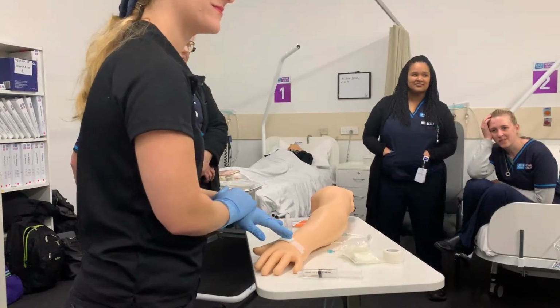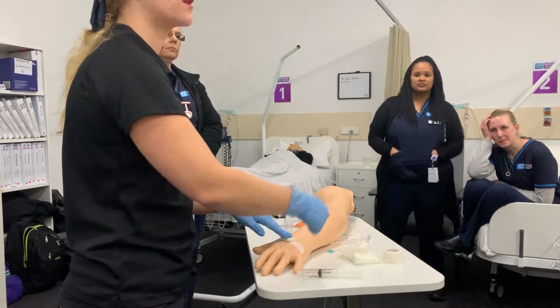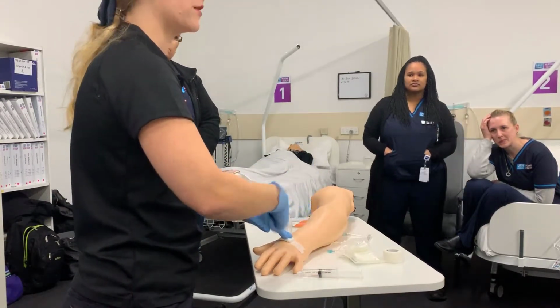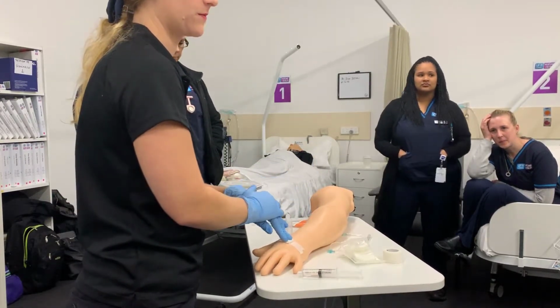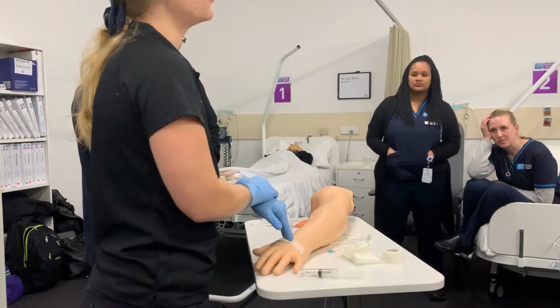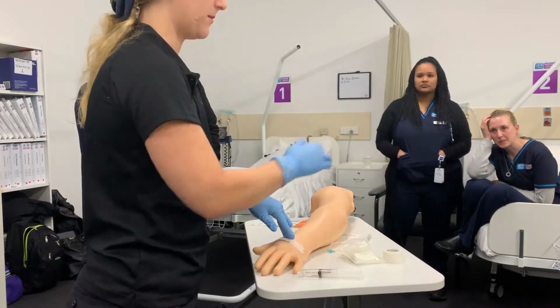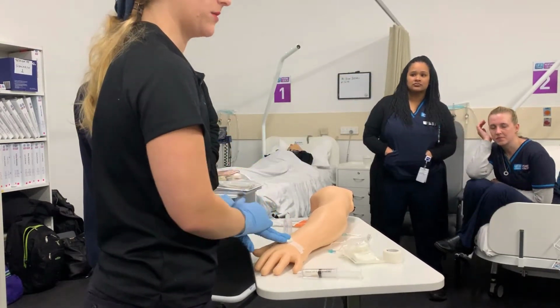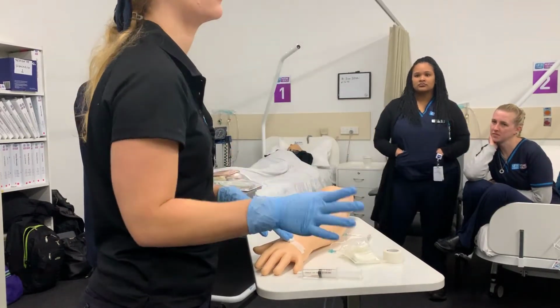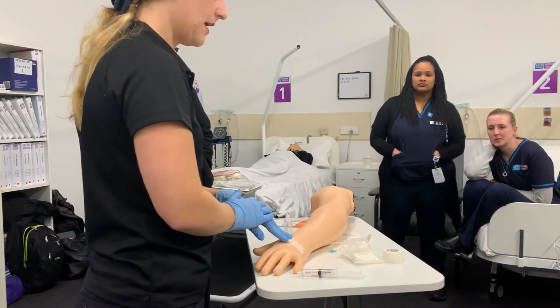And what happens if it just continues to flow? So then you can wrap it with gauze, like with a dressing to hold more pressure. Okay, you could also apply ice packs to decrease the blood flow. Usually it doesn't get to that extent though. Or elevate. Yeah, all the typical ways to stop bleeding. Again, it's in a vein, not an artery, so it is a lot easier to stop the bleeding. Okay, all right.